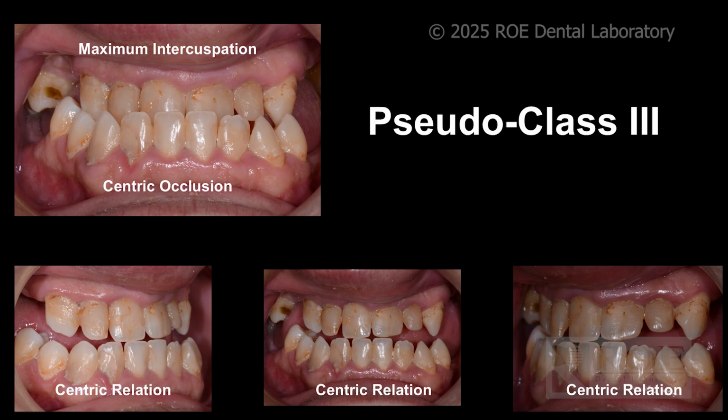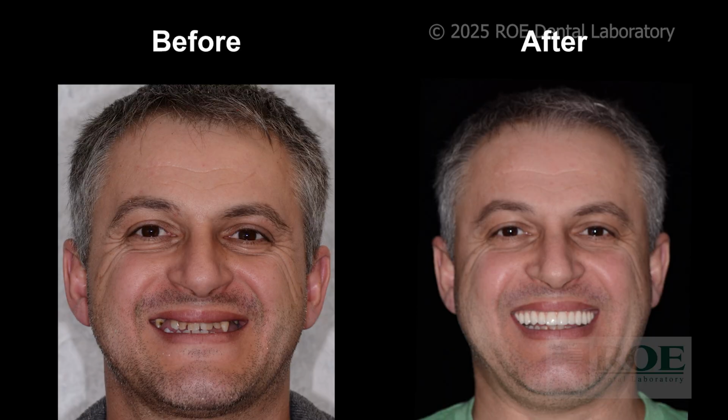I've used a Lucia jig, the little plastic things that they close on just to relax their jaw, and then you can leave that in to take the bite registration. But everybody has their own way. But I use a leaf gauge a lot because most of these really complex cases have shifted and drifted teeth. CR and CO aren't usually the same. And whenever you're going to restore an entire arch or both arches, you have to restore in centric relation. And so here's that patient after we did an upper full arch type of case.